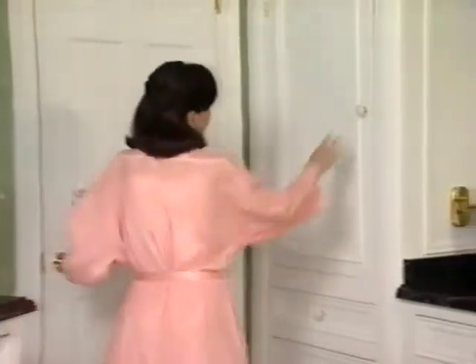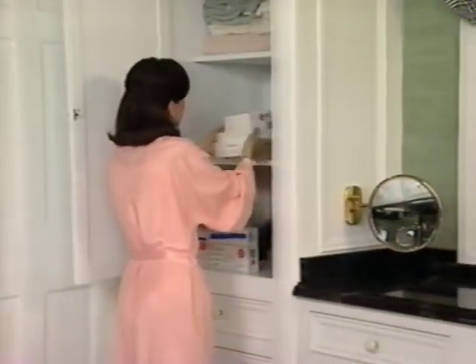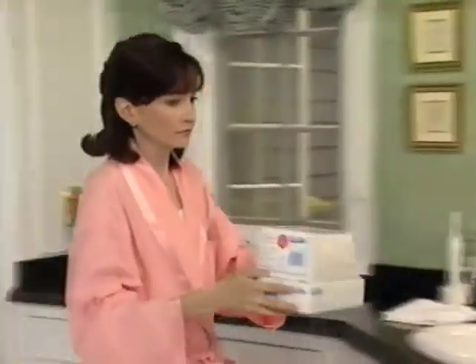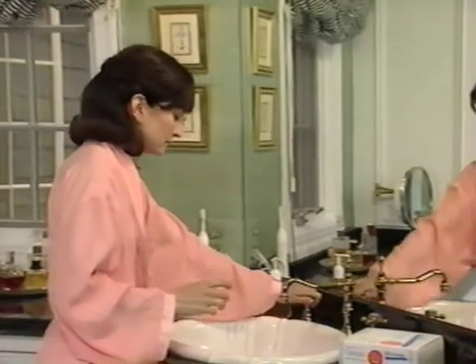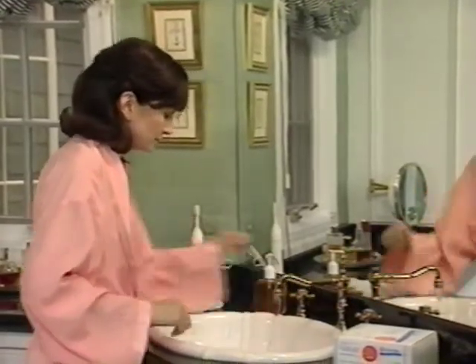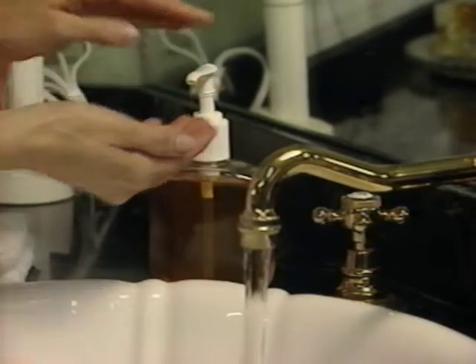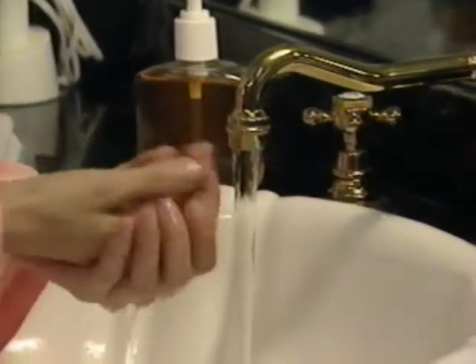Renee has had her ostomy for over 10 years. She will demonstrate the proper technique for applying and removing the SureFit Nutura Ostomy System. Before handling any ostomy system, always wash your hands. Use a mild soap or liquid antibacterial agent.